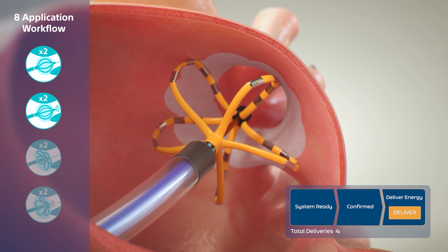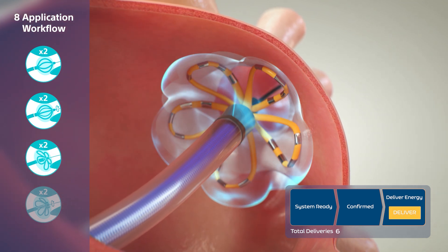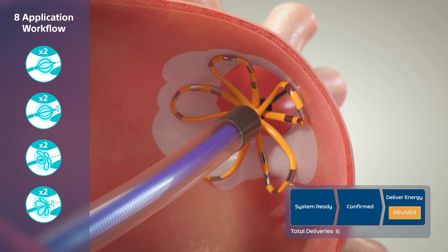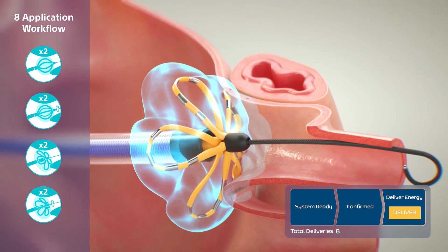The catheter is then deployed to flower configuration and two final paired applications with rotation are performed, for a total of eight applications per vein to complete the workflow and ensure electric field penetration.